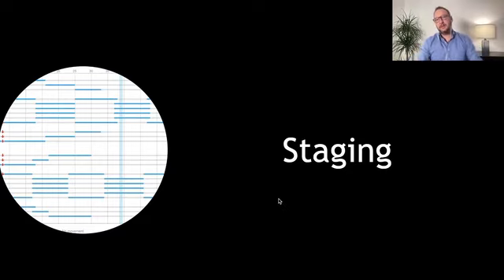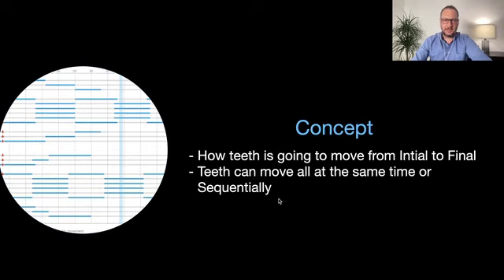Before we finish, okay, and talking about staging, I like to comment that it's something that we're going to discuss over all other webinars, mostly from the 5 to the 12, when we're going to talk about how to treat specific malocclusions, because it's part of the process. So it's important for you at this point to understand the concept, okay? And staging, when we talk about aligners, is basically understanding how teeth are going to move from the initial situation to the final situation, okay?